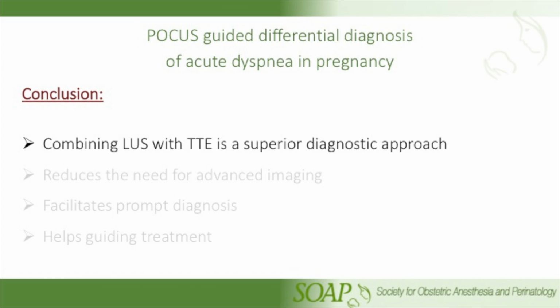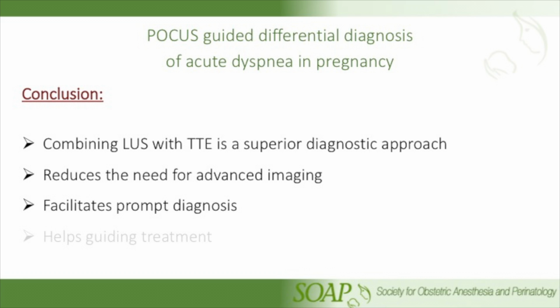In the setting of acute respiratory failure in pregnancy, this diagnostic approach reduces the need for advanced imaging, facilitates prompt diagnosis, and guides treatment.